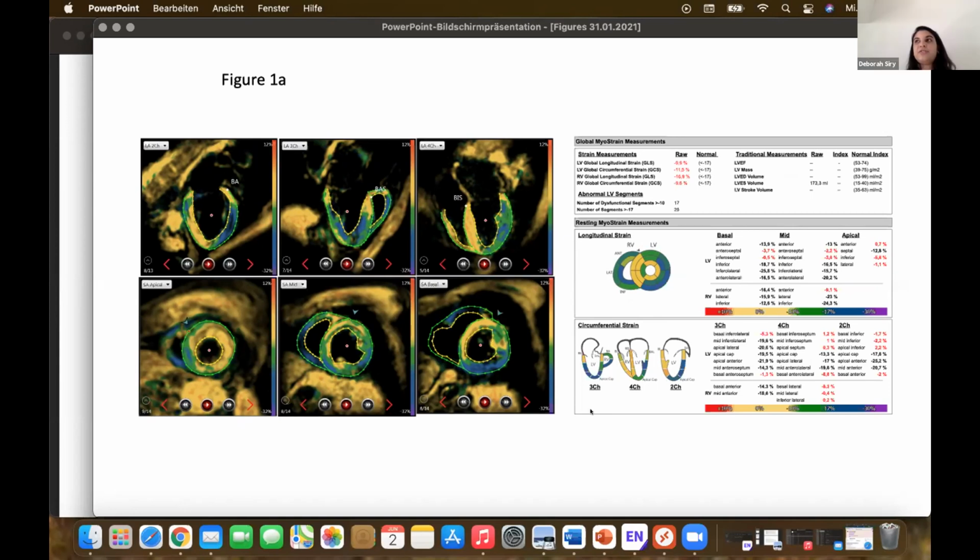Yes, so I think longitudinal strain identifies myocarditis a bit better than the circumferential strain, and that might have played a role because some of the patients who had an underlying cardiac disease did have myocarditis. So maybe to differentiate this from the obstructive coronary artery disease patients, it might be helpful to use the global longitudinal strain. However, for identifying the myocardial injury in total, both were relatively similar. So the area under the curves was relatively similar for both of them.